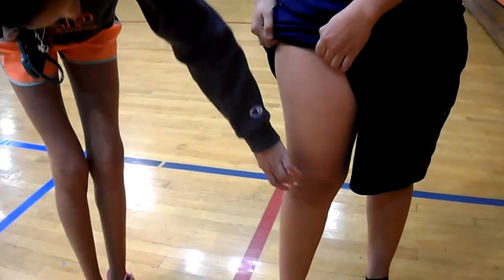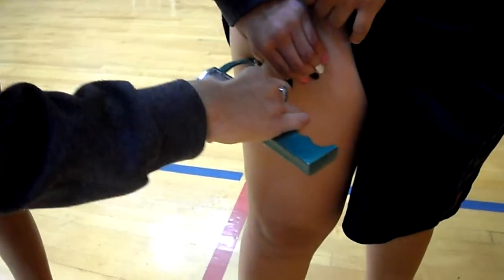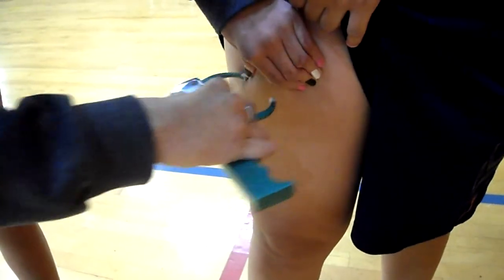The final vertical fold is the thigh. This measurement should be taken midway between the proximal border of the patella and the inguinal crease, or the hip.